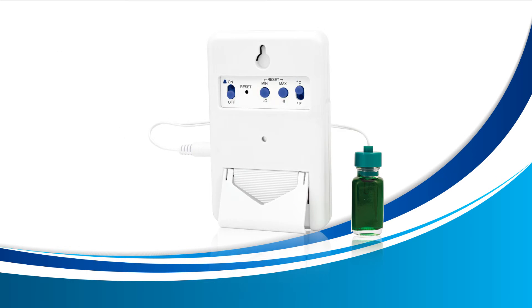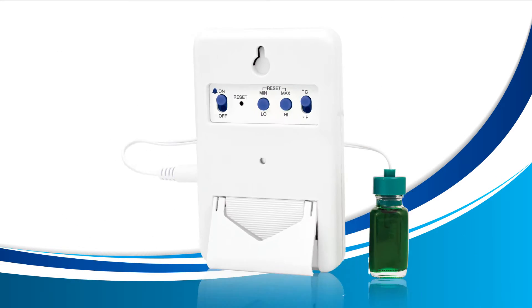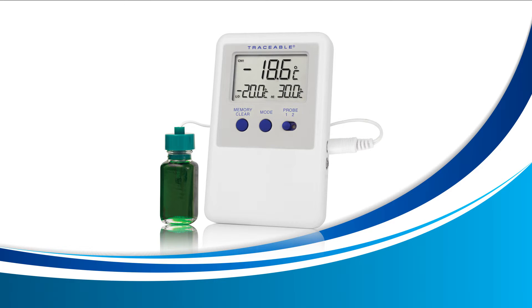Once you're happy with your values, go ahead and turn your alarm on again by sliding the alarm switch to on and you're all done. At this point your alarm may ring, as your probe may not be inside the environment you need it to be in just yet. Press the memory clear button on the front of your device and it will stop the current alarm. Once your current temperature falls in between your new high and low alarm, it will be ready to ring again if it falls below your low alarm or rises past your high alarm.